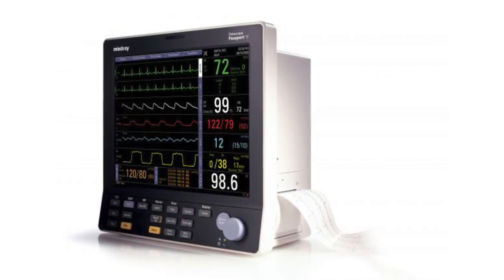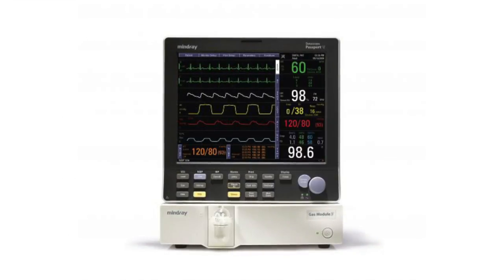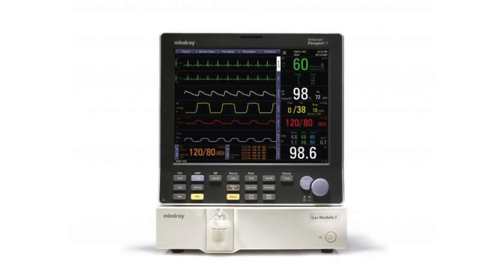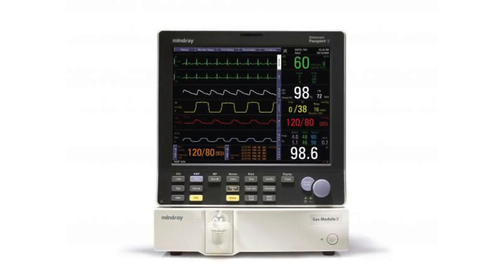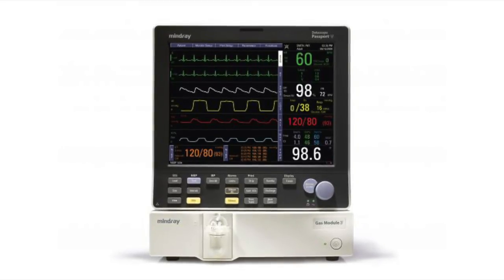Like other products in its line, the Passport 5 utilizes a straightforward, familiar interface so that the user's experience is positive. The Passport 5 is the right combination of simplicity and sophistication and offers a comprehensive feature set in an uncomplicated, easy-to-learn manner.